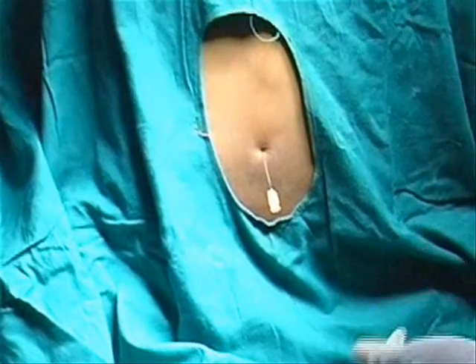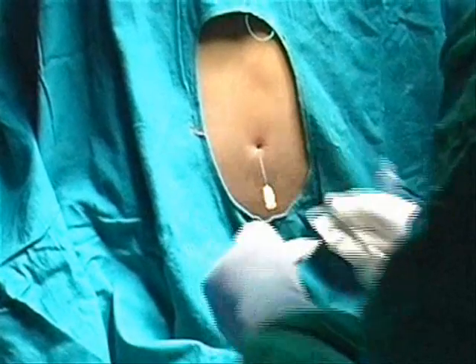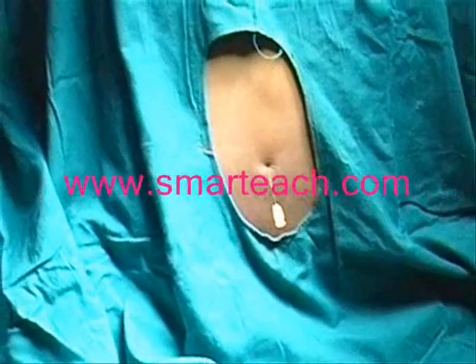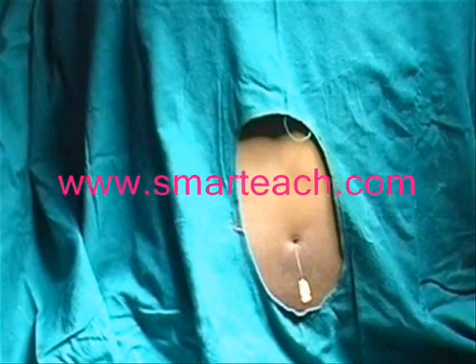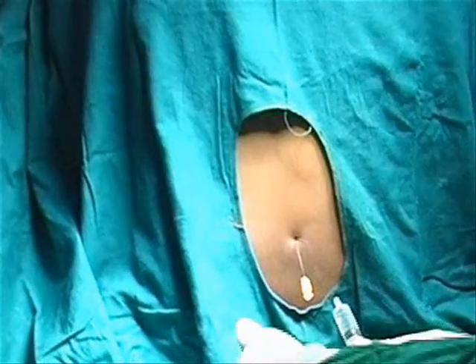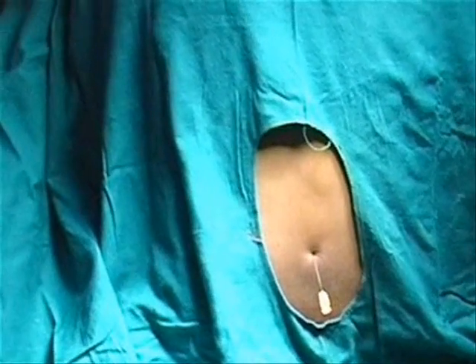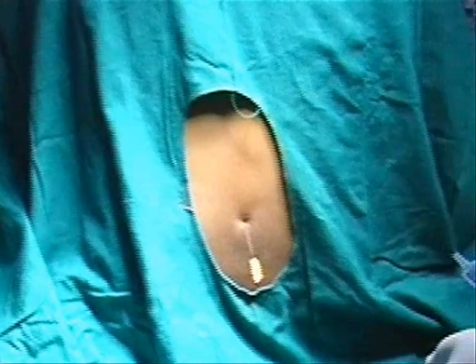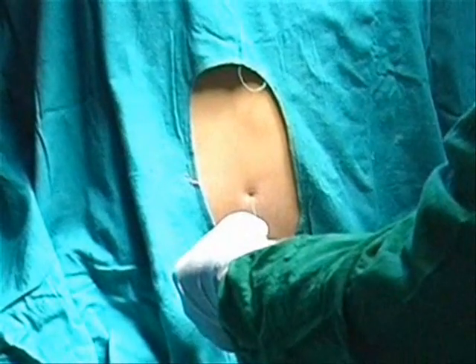Remove the stilet and look for a clear return of cerebrospinal fluid if you are giving a spinal anesthetic. However, if you are taking a sample from a person with an infection, you may get a turbid return or a blood-stained return, as the case may be. Then take the sample for examination if doing it for laboratory purposes, or inject the drug if giving a spinal anesthetic.